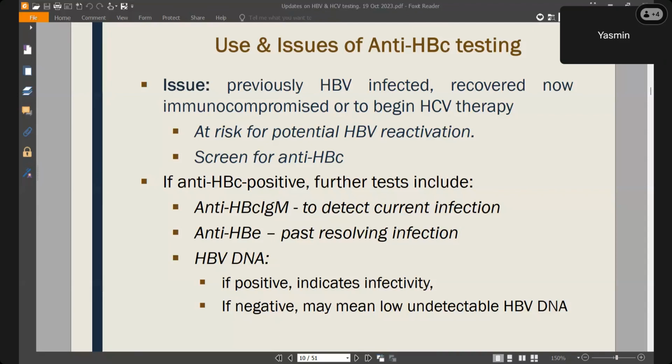That's why when we use any kind of test kits, especially when you do PCR work, you need to find out what its level of detection is. The limit of detection varies between different companies, so be careful. Do not do any kind of comparative analysis between two test kits or two companies, because they have different limits of detection. So ideally, if you use one company, I would suggest you maintain that, to allow you to see a trend. It's very difficult to have a trend when you're using two machines with two different limits of detection. So the use of HBV DNA PCR work does involve some discrepancy. Be careful, you may get some outliers if you're not careful. Next slide.